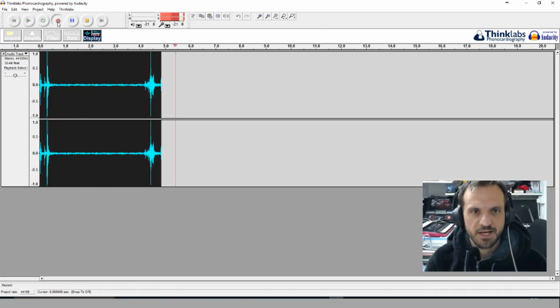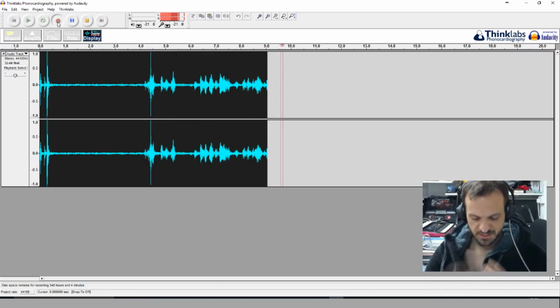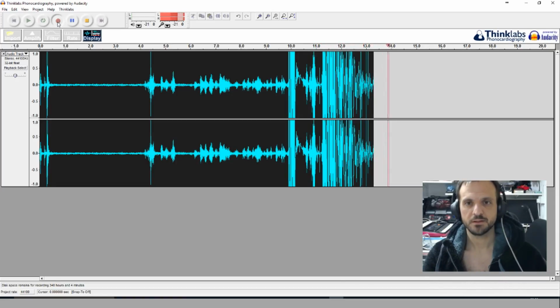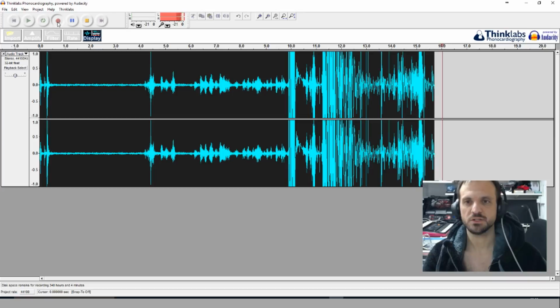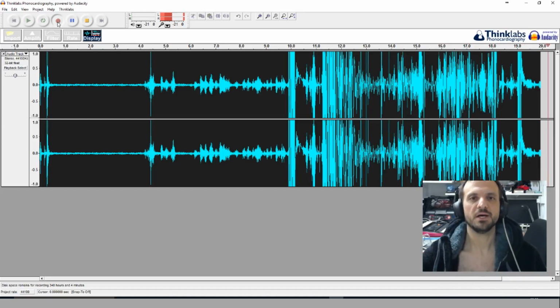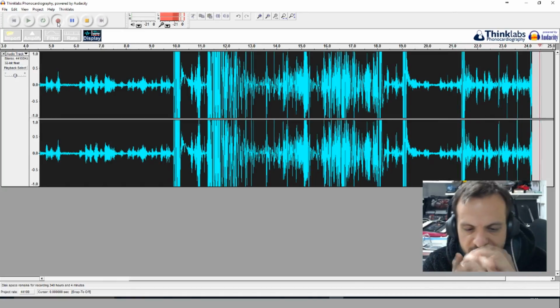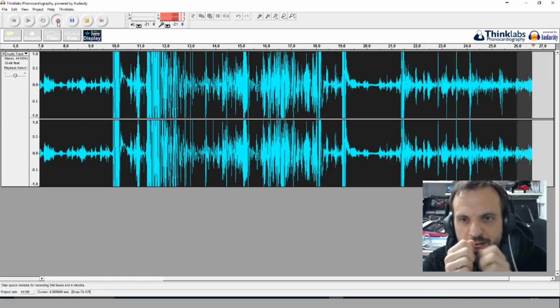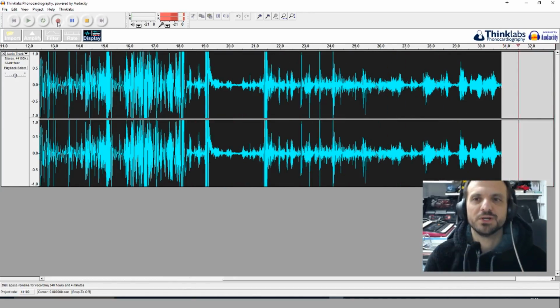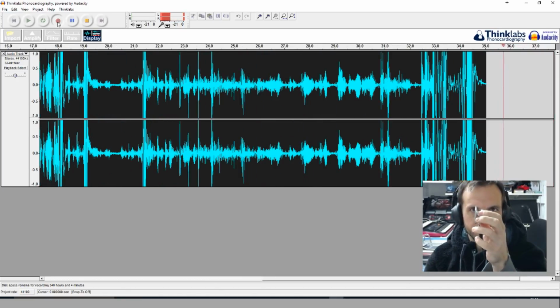See, it's totally flat. It's totally flat because it's good. That's what you want, a response like that. But if I put it on my chest, do you see that? That's all noise. The human body is just making a cacophony of sounds all of the time. And it makes sense in a way, right? Because you've got blood flowing through vessels and veins, and your stomach's gurgling away, and fluids and your lymph nodes and all of your stuff is all working away, creating a heck of a lot of noise. So that's what it's doing.